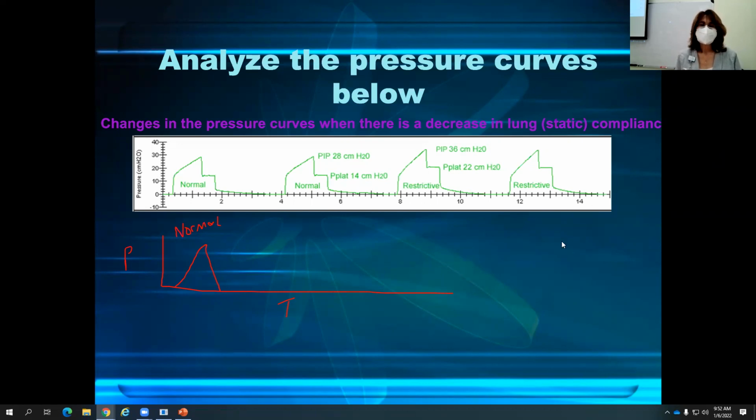Okay, so I just want to recap what we just talked about. We're looking at an airway graphic that shows pressure building during inspiration. Here we're seeing 4 breaths, and on all 4 breaths, the respiratory therapist did an inspiratory hold. That's why we see pressure climbing, and then the pressure stays constant for a bit before exhalation occurs. So we know this plateau is the inspiratory hold.